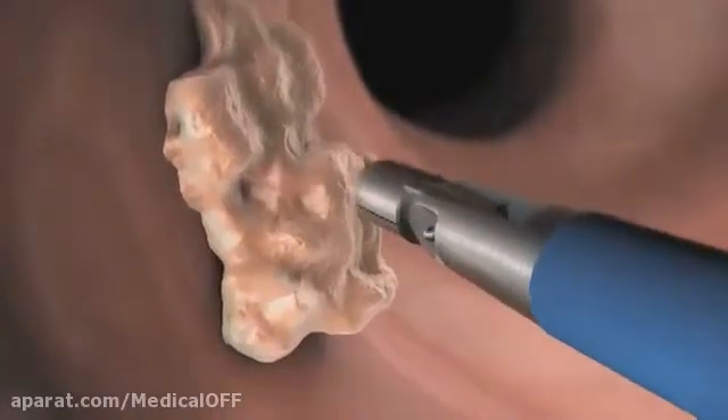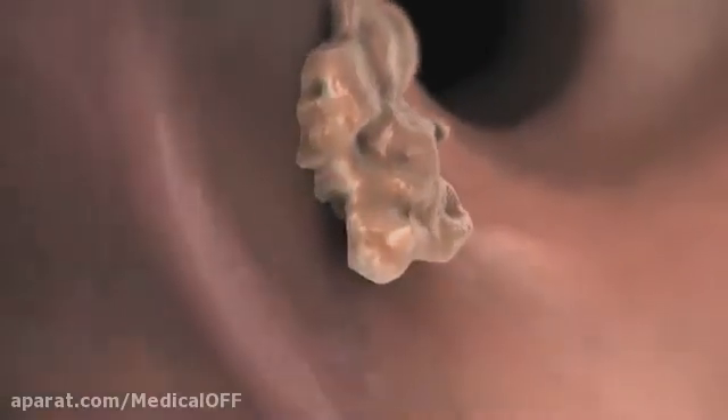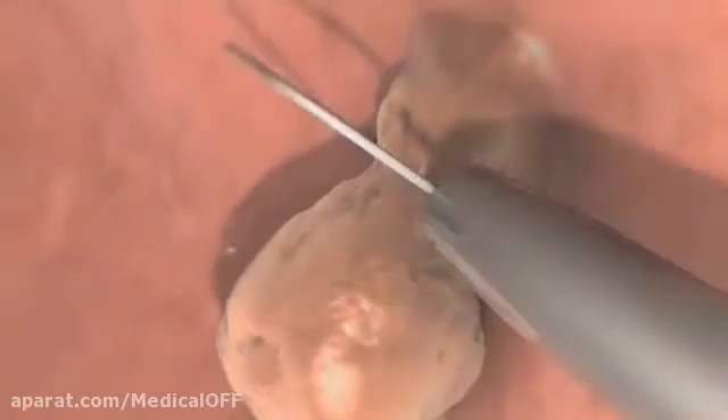In some cases, your doctor may take a biopsy and send it to a laboratory for further analysis. If polyps are discovered, your doctor will remove them with an endoscopic snare.